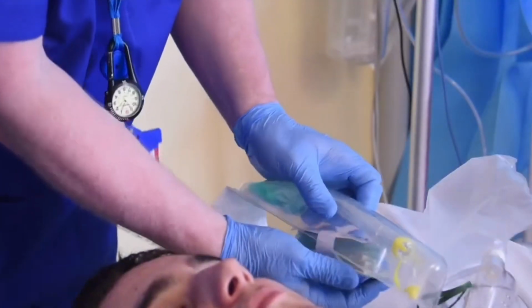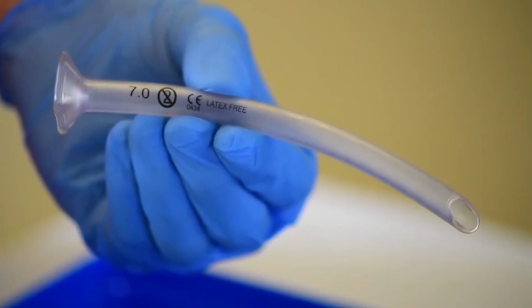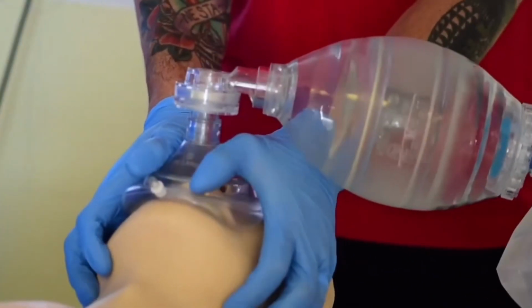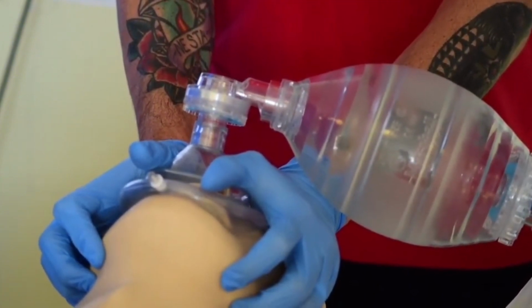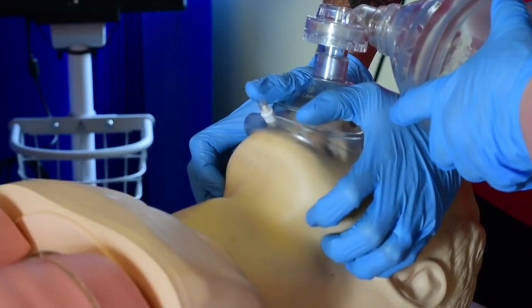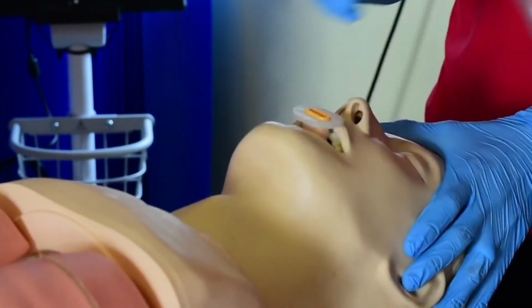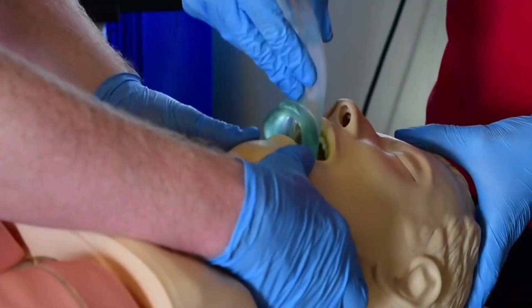Consider the use of simple adjuncts such as oropharyngeal or nasopharyngeal airways. Use a bag valve mask device with two-handed seal and firm ventilation to support an inadequate respiratory rate. If supporting ventilation for a prolonged period of time, consider the use of an iGel device. End-tidal carbon dioxide measurement should be used as rapidly as possible to enable assessment of ventilation and respiration.